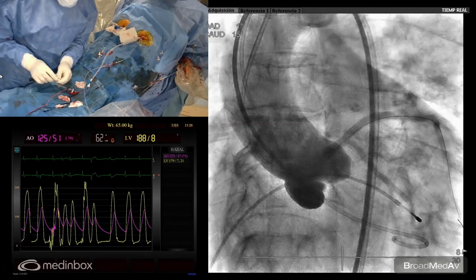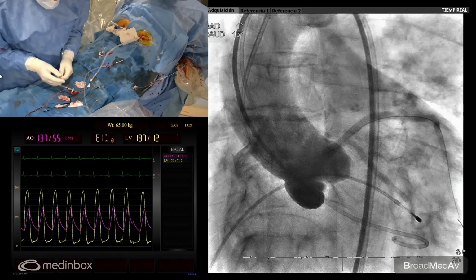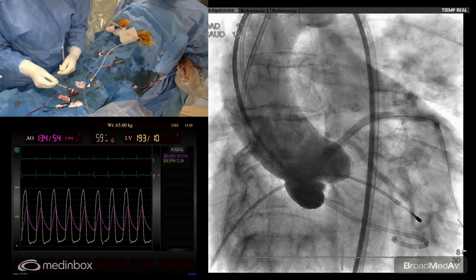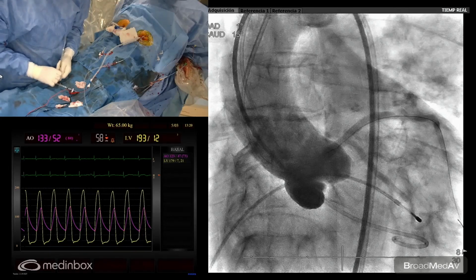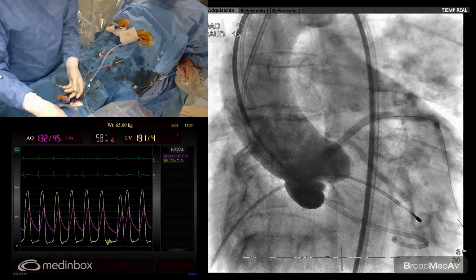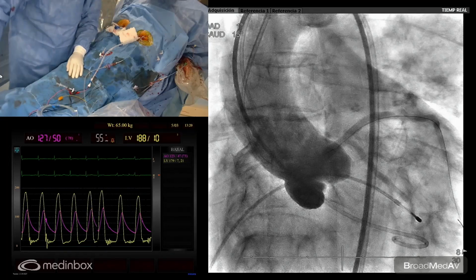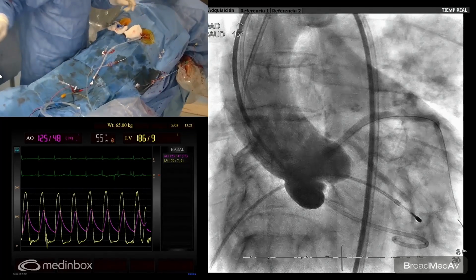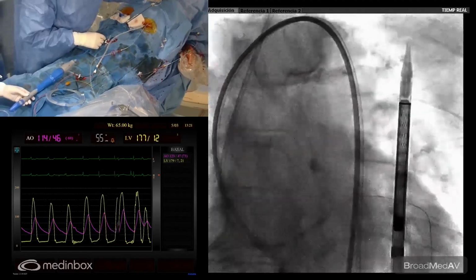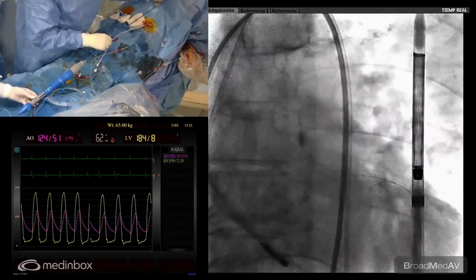If we have some questions from the audience, anyone who can transfer the question, I can answer. One comment would be if there is another option to protect this left main, because if we have to treat it, at the end of the day, we are going to end up with a chimney technique. But for this old lady, I think chimney is okay. In a young patient it could be a problem. So here we have the paddles, perfect. We can rotate and everything is okay.